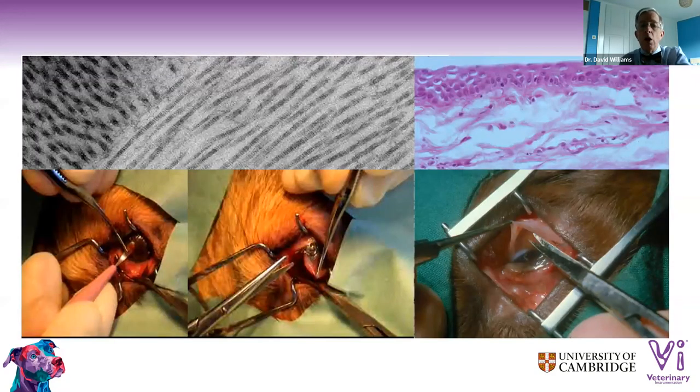And that means that when you're looking at tissues to cut, you need to be thinking about what's going on in the anatomy and the microanatomy of the tissue. So if you've got on the right-hand side conjunctiva that you're cutting, you've got epithelium at the top.